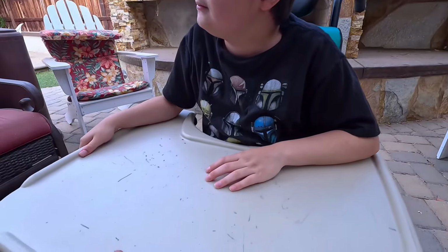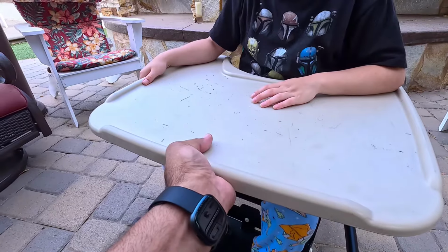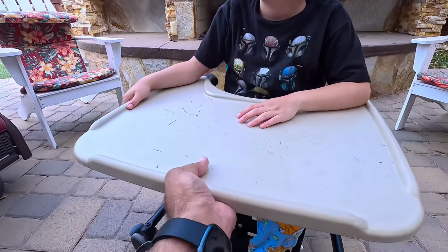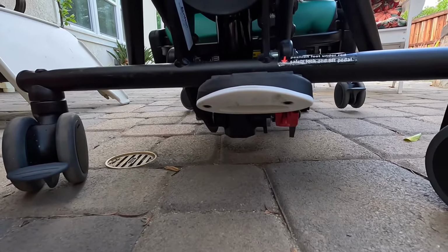And to remove is just the same thing. So you're going to grip it in the front and you squeeze the handle, and then you're going to pull it straight off. Raising and lowering the chair is very simple. It uses a single foot pump.